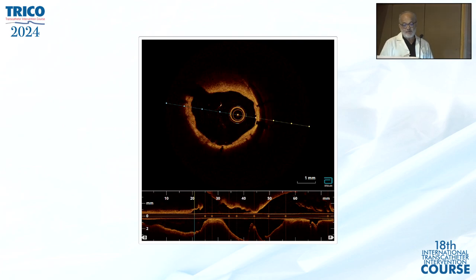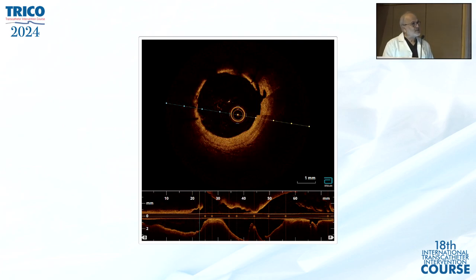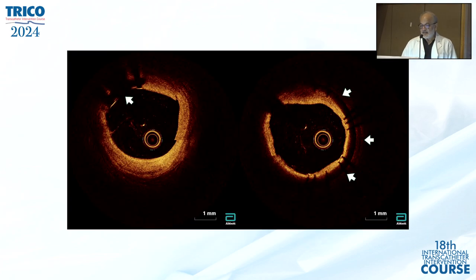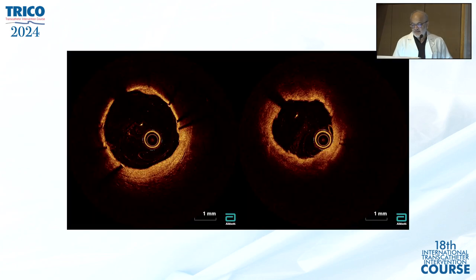Patient is awaiting follow-up angiography within a month or so. So next time we can show that. And this was the area we kept open. And you can see here the difference. This was a red thrombus on the first day, and on the second day it is getting converted into mixed and then ultimately the white thrombus.